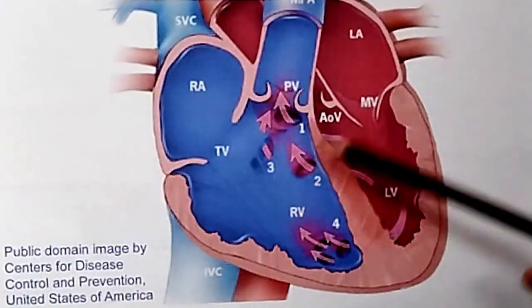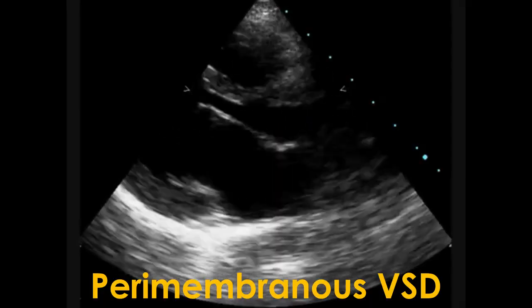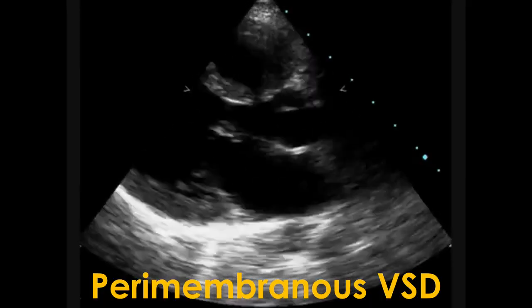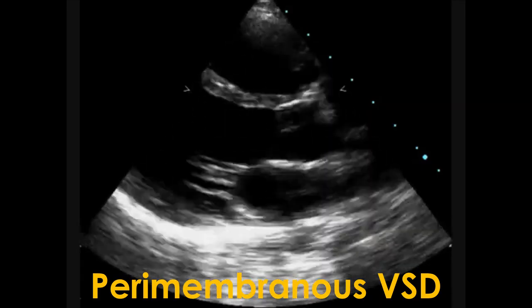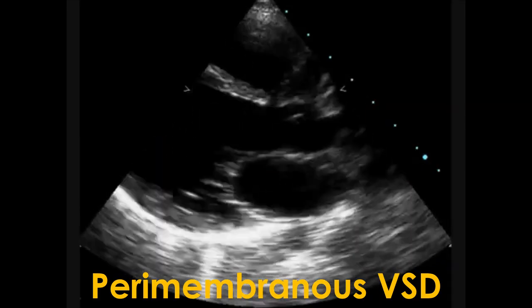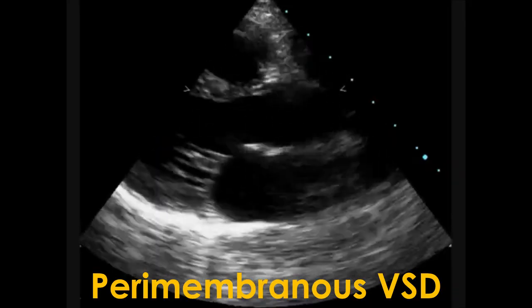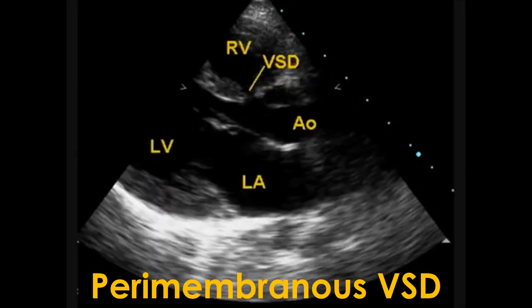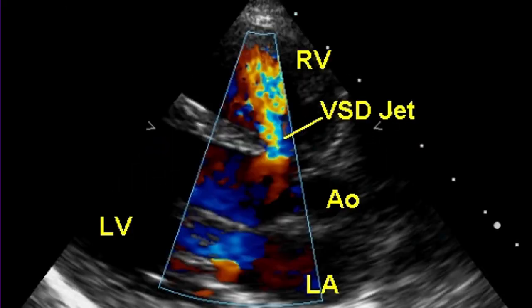perimembranous ventricular septal defect. Parasternal long axis view showing right and left ventricles, left atrium and aorta. Perimembranous VSD is seen just below the aortic valve. It is subaortic in location. Size of VSD is compared to the aortic diameter. Here it is a small VSD, as it is less than 1/3 of aortic diameter.